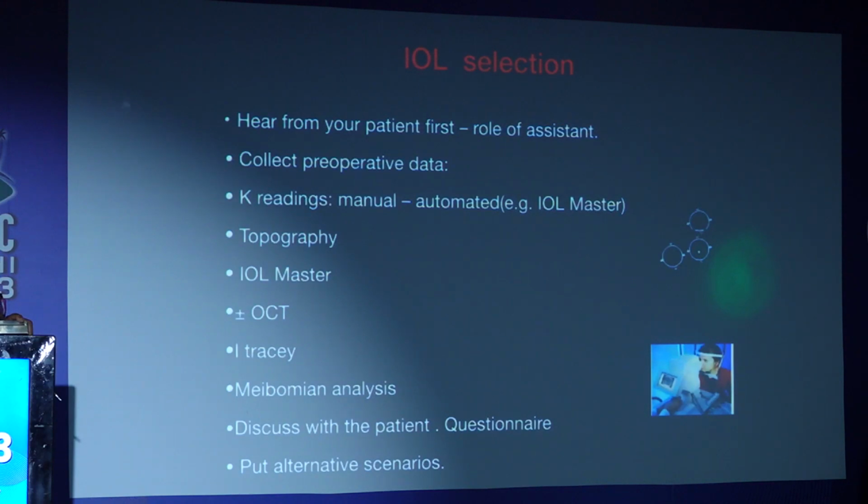And this is one great tool which I would always subject for my toric patients preoperatively and postoperatively to assess the right location of the lenses. Meibomian analysis, yes, it's great, and we have this LipiView. So any patient where we have any kind of dry eye, we would first subject these patients to the LipiFlow, and then subsequently take these patients for phaco-refractive surgery.